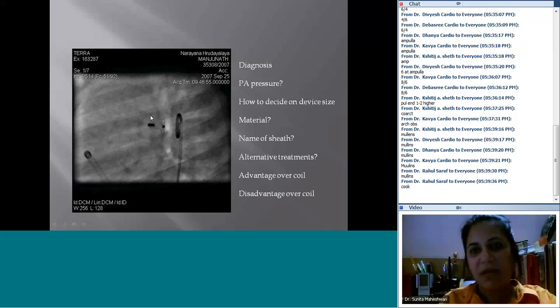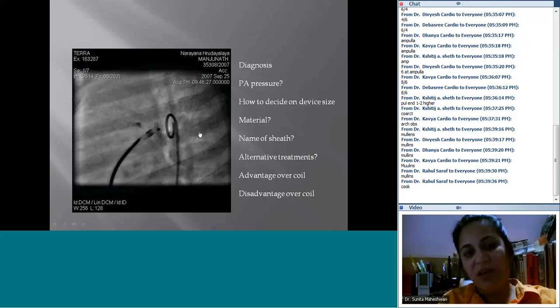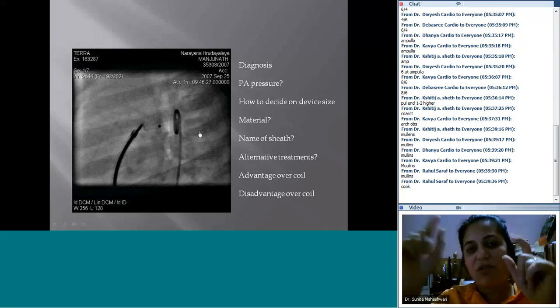So any of these sheaths. Now, one of the things that we discussed last time, when you take it off, right? Here, you're taking it off. You notice by leaving a gap between the end of the sheath and the device, so that you're not supporting the device and you don't have too much of a stretch on it. And then you're releasing it.